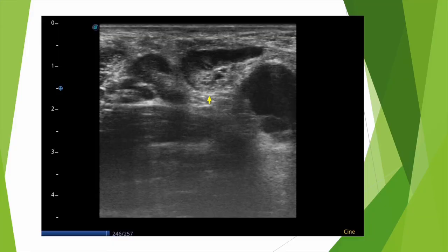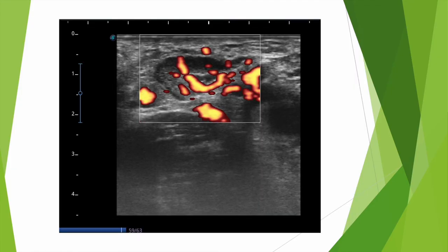Another lymphadenopathy was studied. Is this lymphadenopathy suspicious? Well, yes, it is suspicious, because it shows, especially here in the hilar area, cystic spaces. So it meets a criterion for suspicion, which is the presence of anechoic spaces, cystic spaces within the lymphadenopathy. Now, this lymphadenopathy is also suspicious. Very intense vascularization that is no longer just hilar. It extends beyond the hilum, and the vascularization gradually becomes chaotic. So another criterion for suspicion in another lymphadenopathy in this patient.